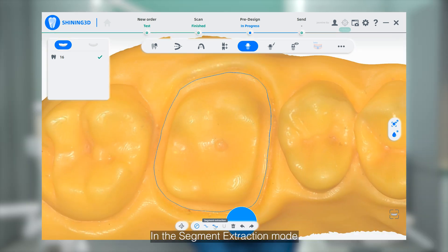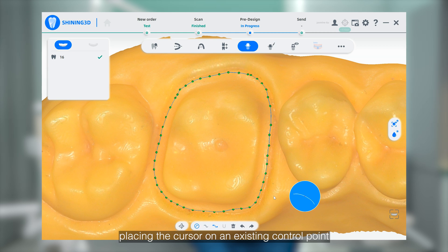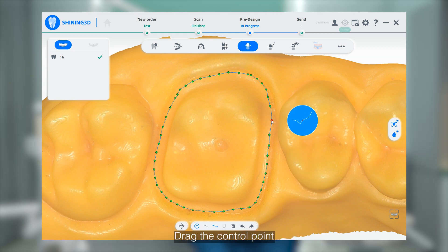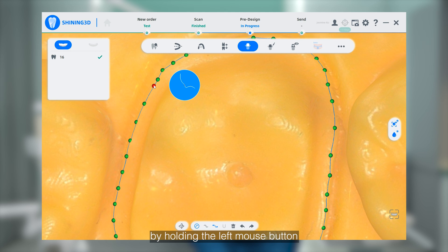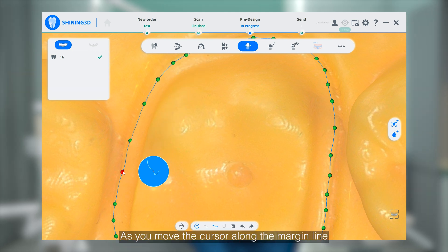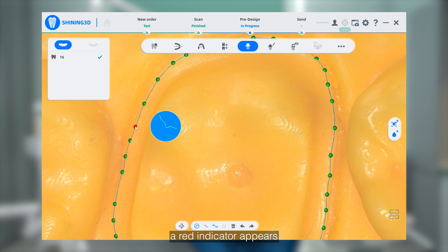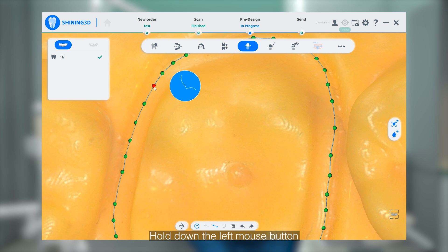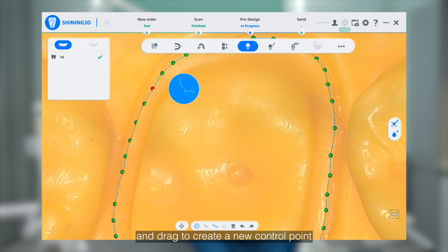In the segment extraction mode, placing the cursor on an existing control point changes its color from green to red. You can drag the control point by holding the left mouse button, and delete it by double-clicking the right mouse button. As you move the cursor along the Marginal line, a red indicator appears showing the position for adding a new point. Hold down the left mouse button and drag to create a new control point.